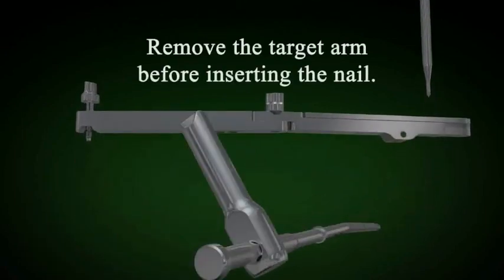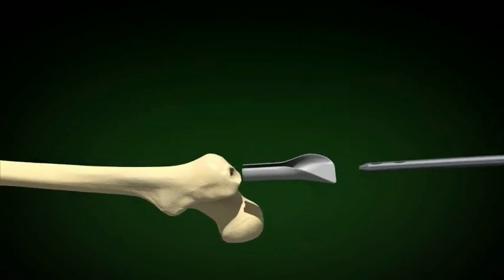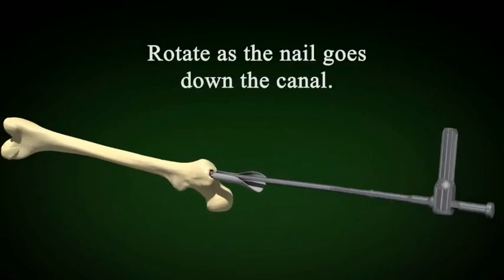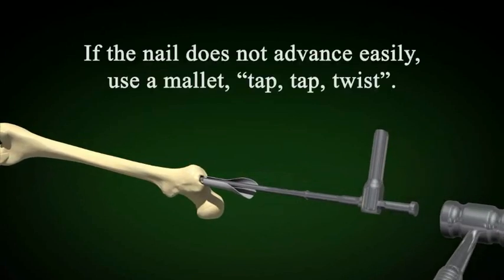Remove the target arm before inserting the nail. The nail is inserted using rotation. Please use the tissue protector so that the nail does not touch the skin. The one and a half degree bend is crucial and as you rotate the nail, it will create a larger track.